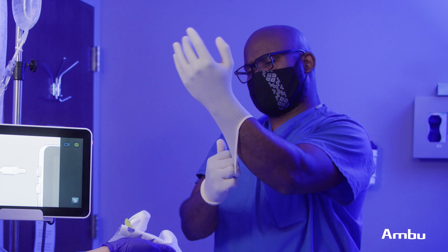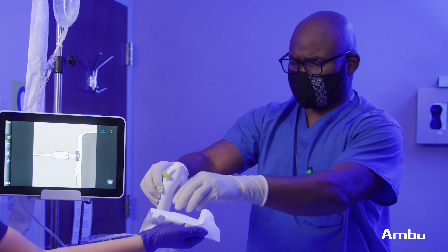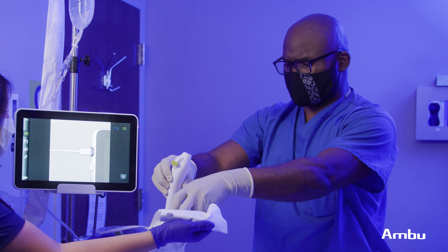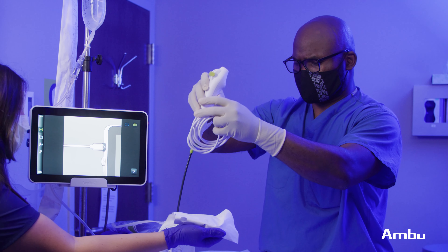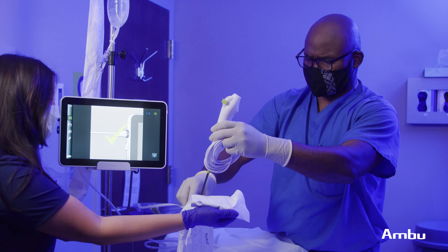By converting to Ambu's ASCOPE 4 Cysto, we've really dramatically improved our efficiency. We've been able to eliminate sterile reprocessing in our operations here in the clinic and also eliminated the risk of infectious agents being transmitted to patients.